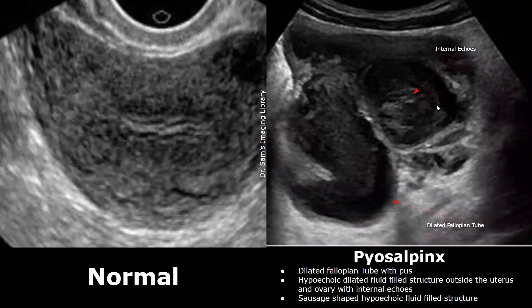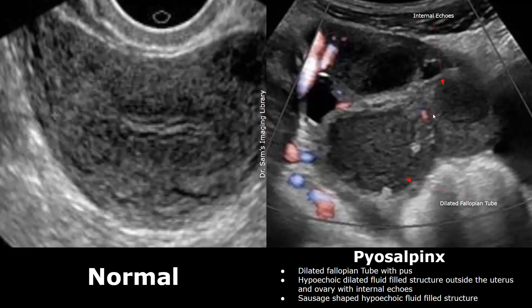A piosalpinx refers to a pus-filled fallopian tube. It has almost all the same features as hydrosalpinx except for one: internal echoes inside the structure. Medium-level echoes will be seen inside the structure. Here is another case showing piosalpinx — internal echoes can be seen inside this dilated, fluid-filled structure outside the uterus and ovary.